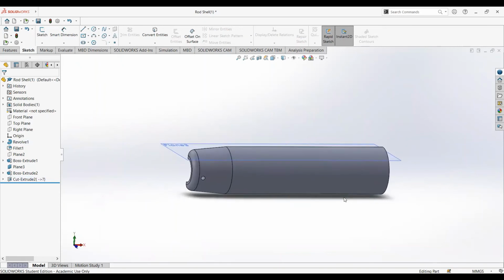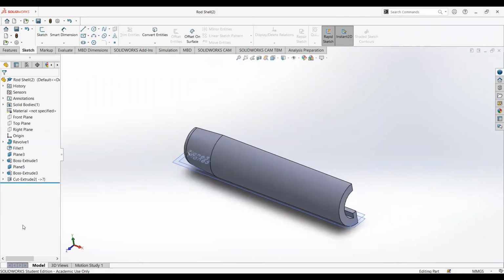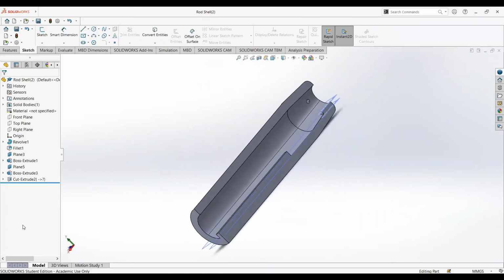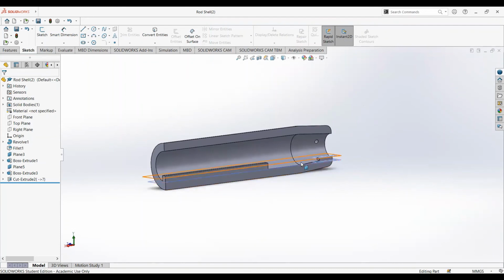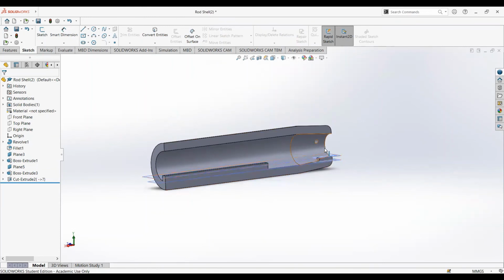This is one of the sides of this rod, and then we created another side, which is exactly the same dimensions and everything. And I'll show you really quick how we did that part. So yeah, this is another side of the shell. As you can see, it's very similar to the other thing I just showed you. The small difference is right here. We boss extruded this part. This is so we can put our top clamp right here. It'll fit better if we cut this little part. Yeah, and all the other steps are exactly the same as the other shell I just showed you.